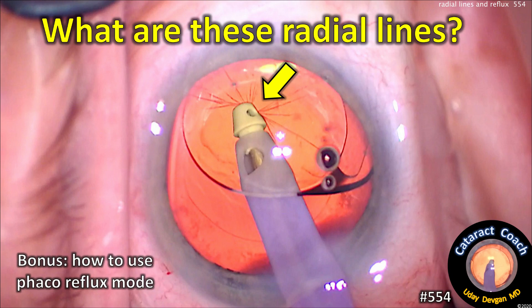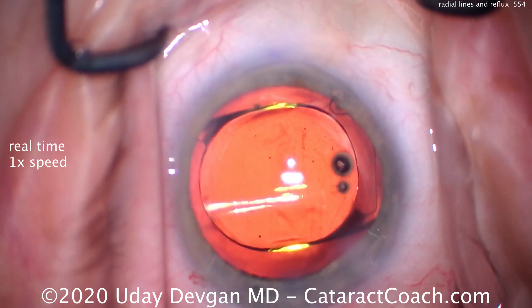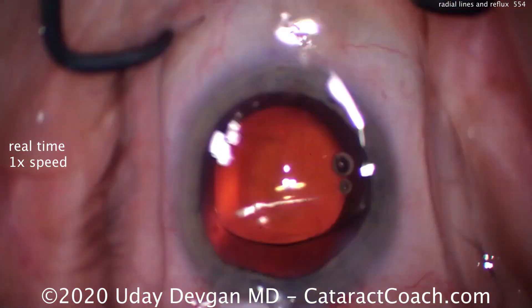cataractcoach.com — what are these radial lines, and bonus: how to use phaco reflux mode. Look at this routine case: everything went normally, nice capsulorrhexis, nucleus came out easily, cortex all cleaned up. The IOL is now placed in the capsular bag and we're going to use the IA probe to go under the IOL to remove viscoelastic.